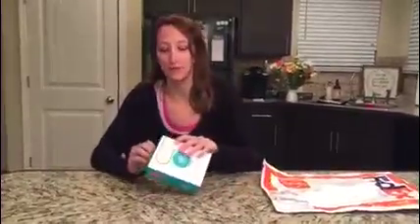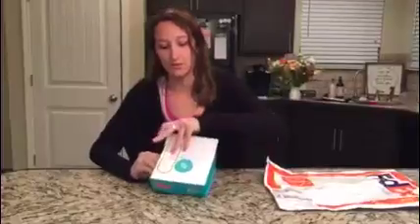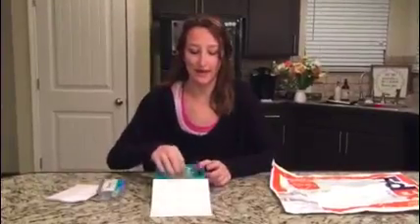After you register at JScreen.org for your kit, you're gonna get this in the mail. It's also gonna come with a FedEx envelope so you can send it off to the lab. Inside we've got instructions like we're gonna go over today, the collection kit, and a specimen bag for you to put everything in when you're done.